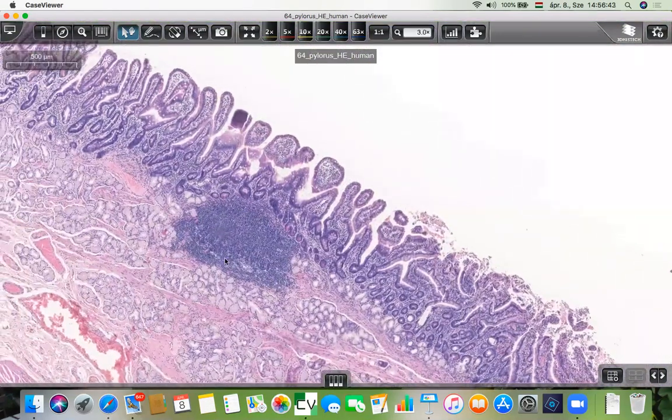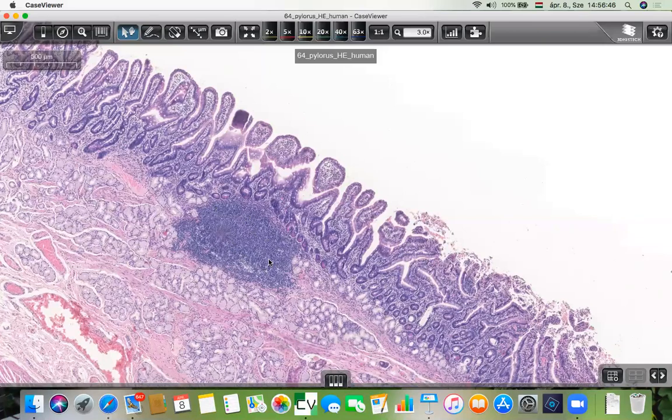Yes, there is a lymphoid infiltration. Lymphoid infiltration is quite typical. It's not weird, because you know, with the food we have numerous bacteria, fungi and viruses as well. So they are in contact with these surfaces, with these eventually dirty foods and liquids. So we need the help of the immune system. That's the reason why we can find numerous immune cells and lymphoid aggregations.